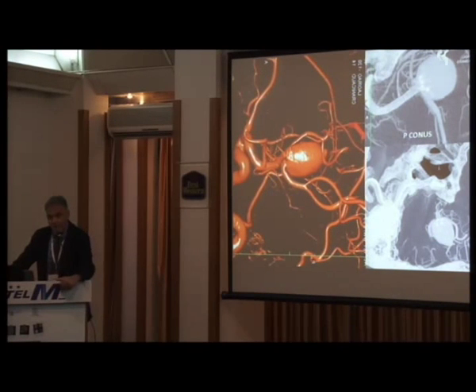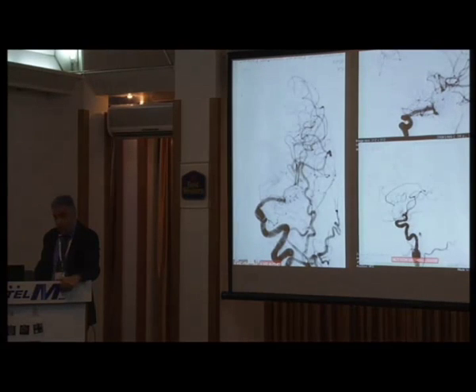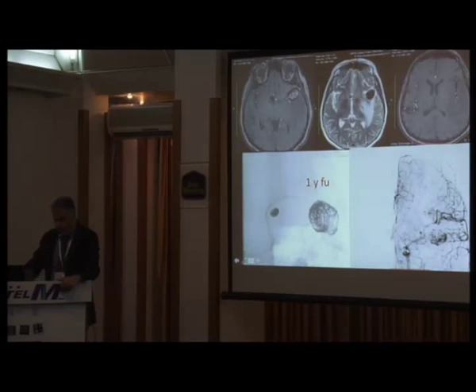Another tool appeared in the last years, this is the P-conus, a stent combination with some wires, that protect the dangerous angles. And this is the P-conus, you can see it better down here. After coiling, it looks good. But look at the 1-year follow-up. The whole aneurysm sac is filling again, all the coils displaced, and much more importantly, the patient had a headache with a cerebral edema because of the pulsatility of the sac, and the patient was under aspirin and Plavix.